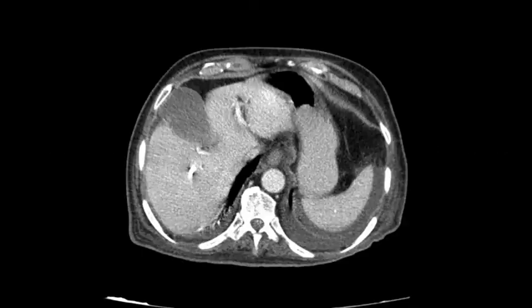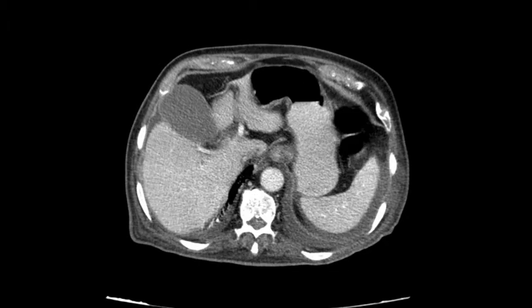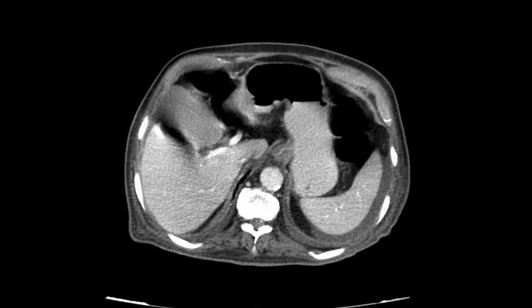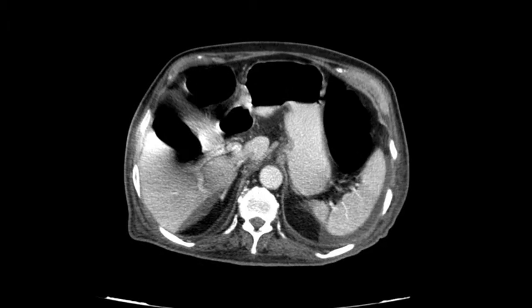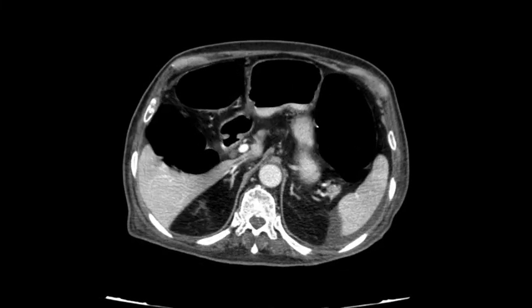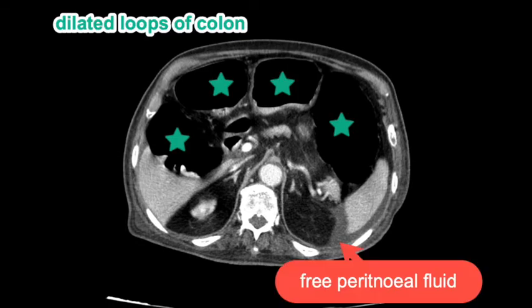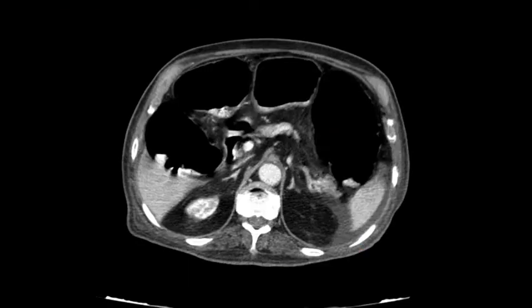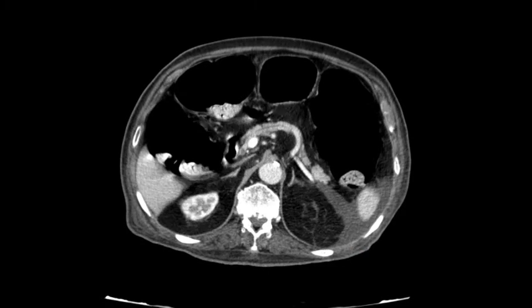Here I present a 90-year-old man who presented with acute abdomen to the ED. In the CT scans you can see that there is a small amount of free fluid in the peritoneum and the colon loops are dilated with thin walls.